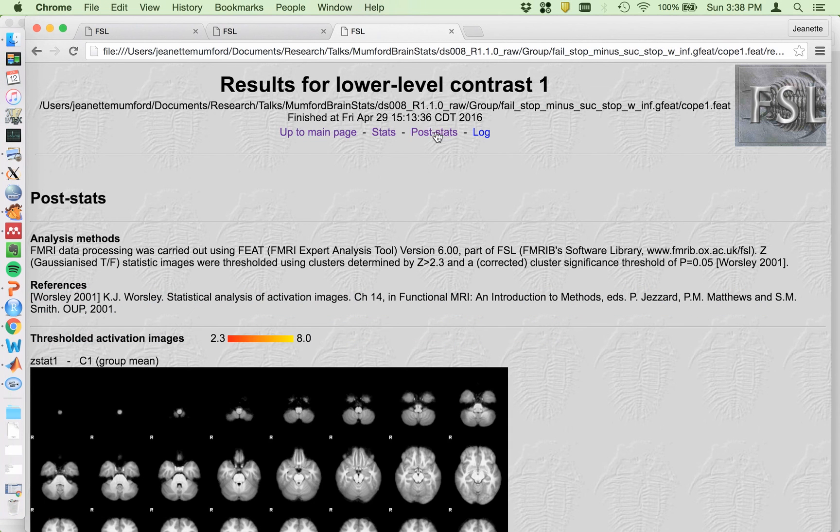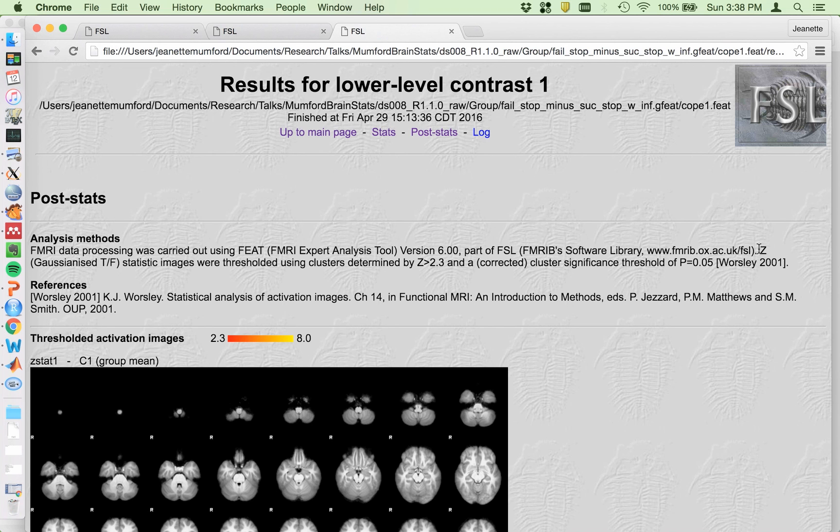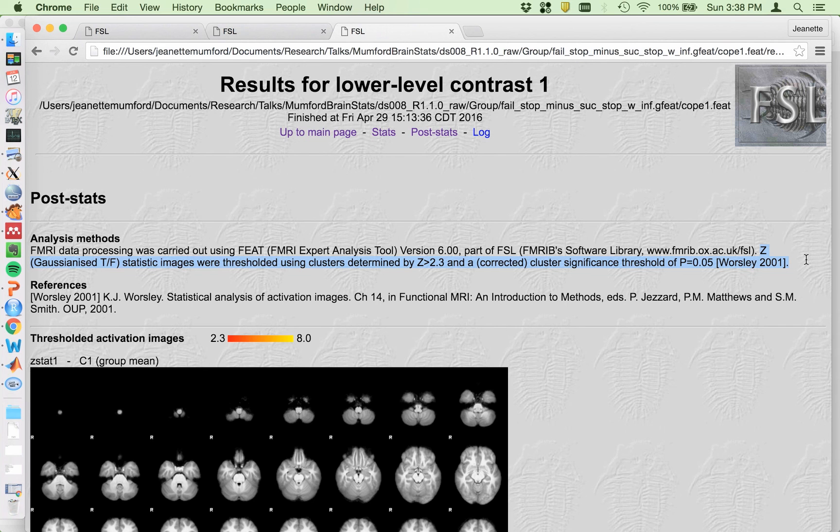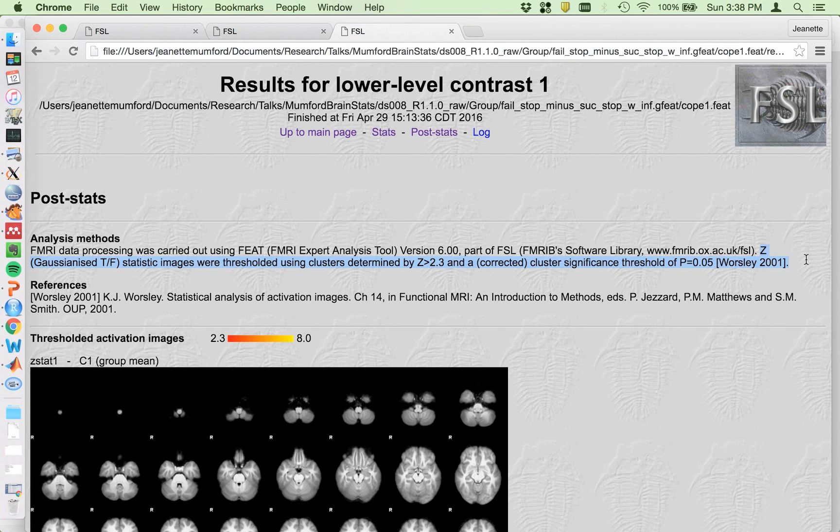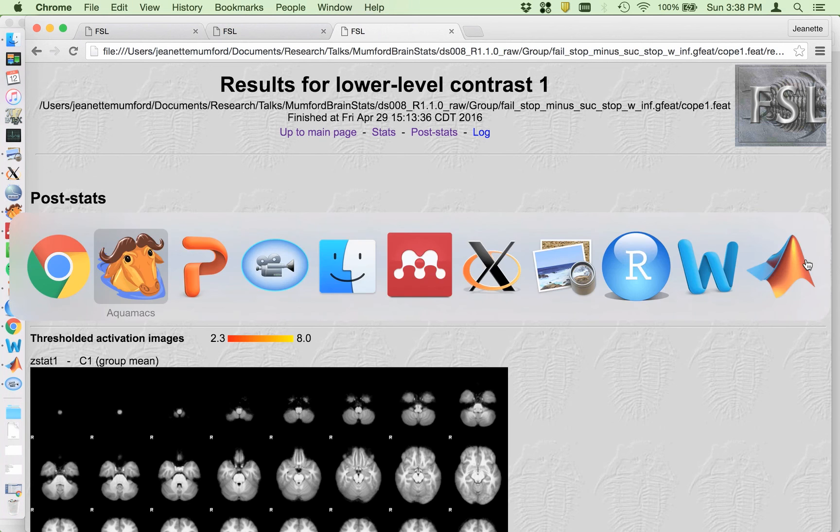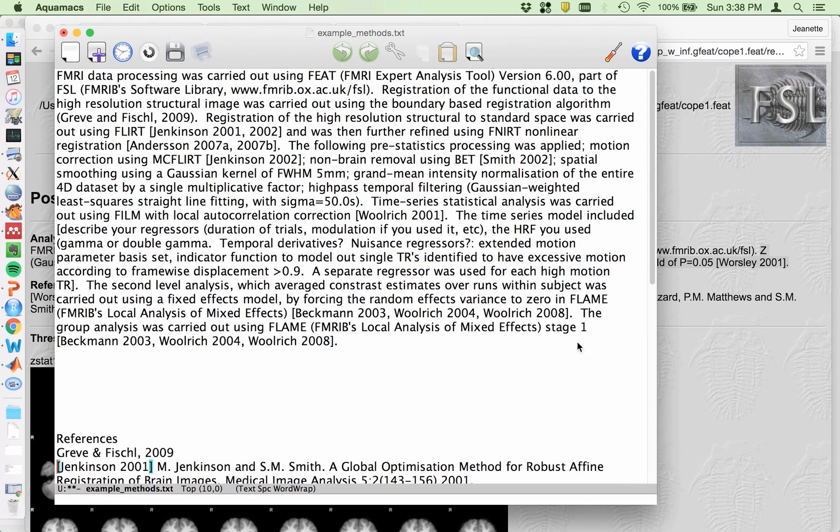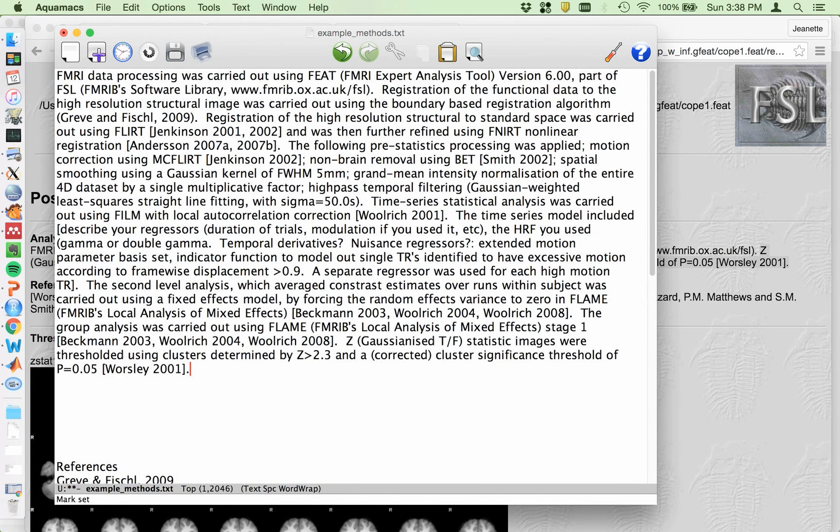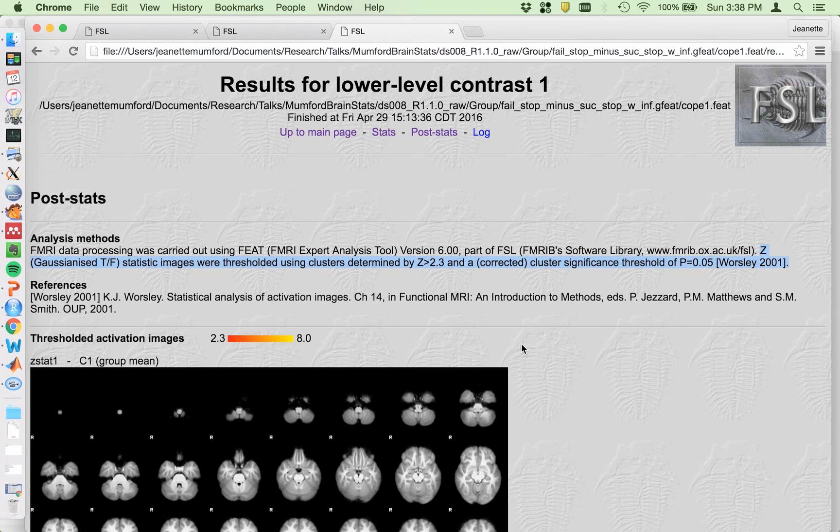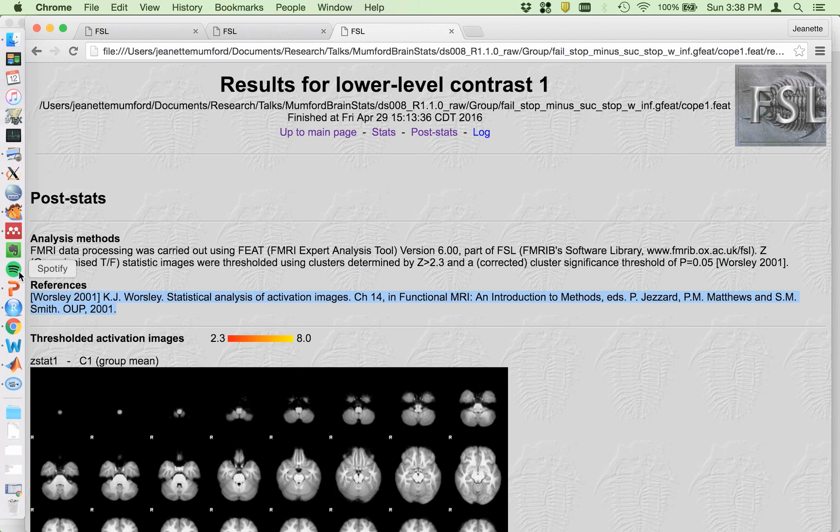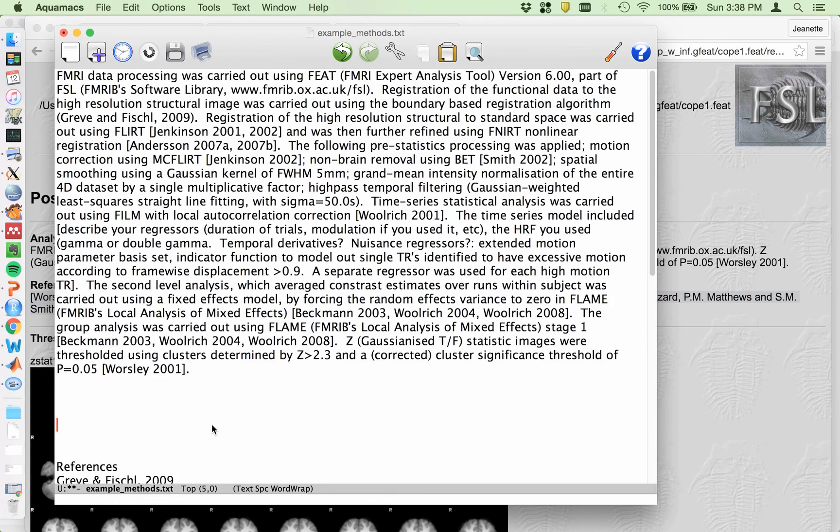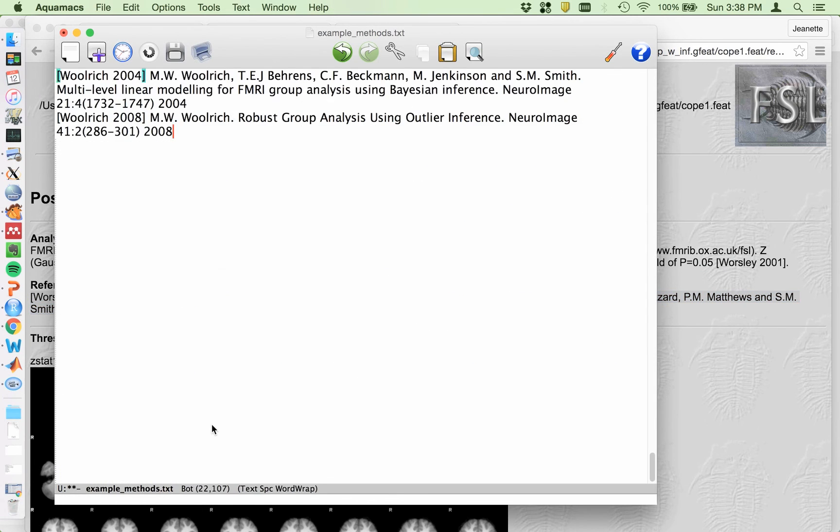And then post stats. Finally, the thresholding thing, the thing that Russ was just pointing out, people don't have. And all it is, is this sentence. And this is all you need. They're thresholding using clusters determined by Z greater than 2.3 and a corrected cluster significance threshold of P equal to 0.05. Just copy it right out of here. If this is the only thing you copy out of here, that would be great. And then the reference. All right.